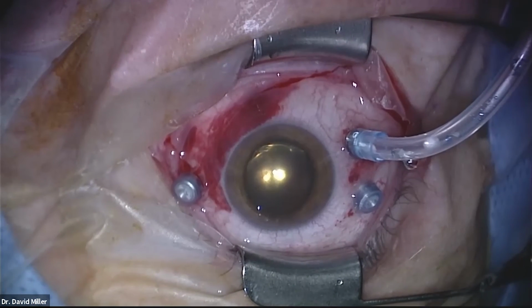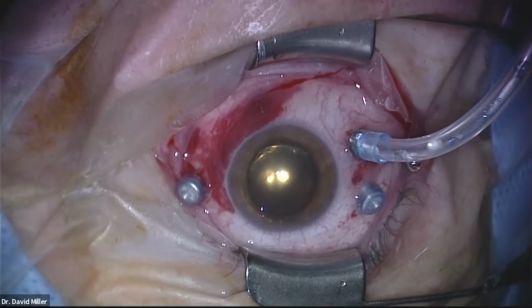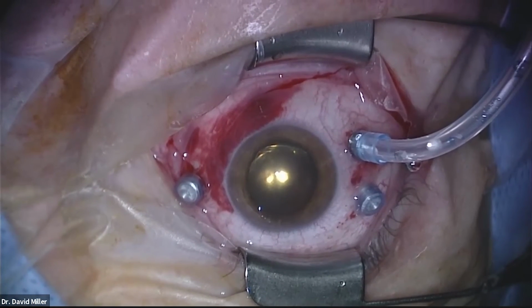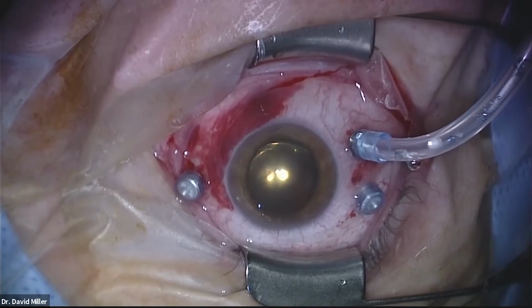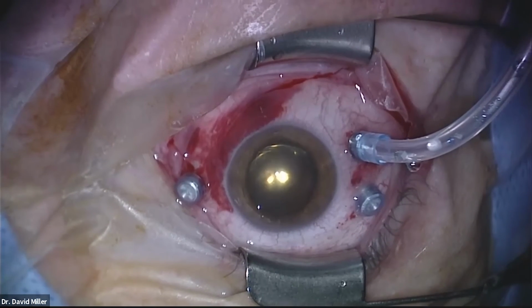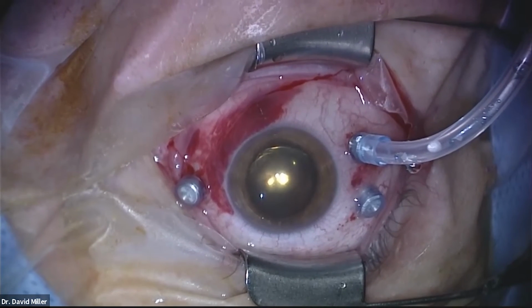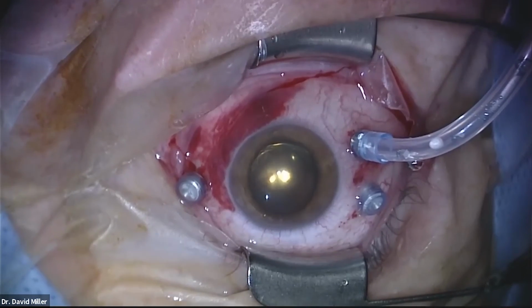Okay, I think the case went really well. We're just putting the gas bubble in the eye. And we'll have you hold your head down for the week, looking at your toes, or reading a book in your lap, or a flat screen TV on the floor will all work. We're going to ask you to hold your head down for about 50 out of 60 minutes. You can pick your head up for about 10 minutes an hour, stretch your neck, eat and drink something. And then when you sleep, the left or the right side is fine, but face down.